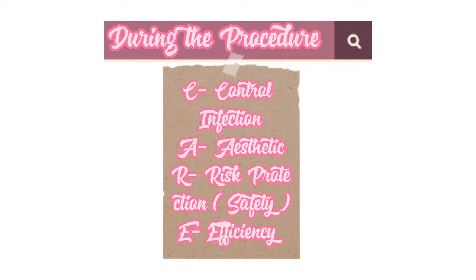Provide client safety. Keep side rail up on the far side of bed. Continue to observe the client while performing the procedural steps. Remove obstacles from the area so the client does not trip. Make sure there are no spills or liquid on the floor on which clients could slip. E. Efficiency. Perform procedure in an acceptable period. Demonstrate coordination in handling equipment. Follow correct procedural steps.